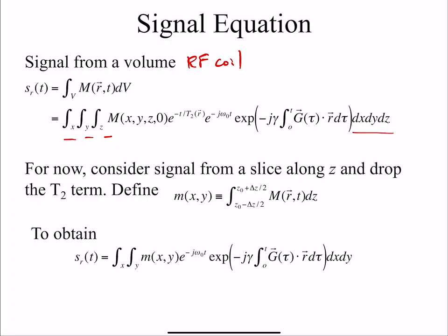Okay, so in MR we can do either 2D or 3D or 4D imaging. So 2D imaging is just we're going to acquire the images slice by slice by slice by slice. Okay, and the cool thing is, and we'll talk about probably next week how we do that, but for now it turns out that by using the gradients in a clever fashion we can excite magnetization only in a slice. Okay, so that way we can just look at what's in a certain slice. All right. So for now we'll assume we can do that. Next week we'll talk about how we do that.